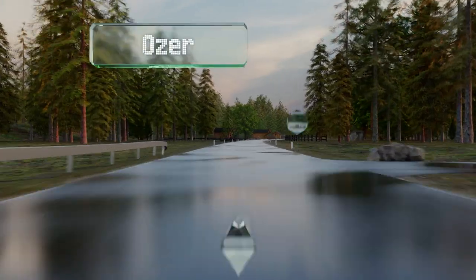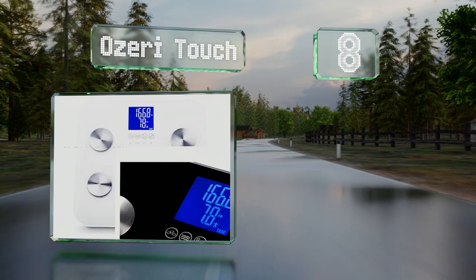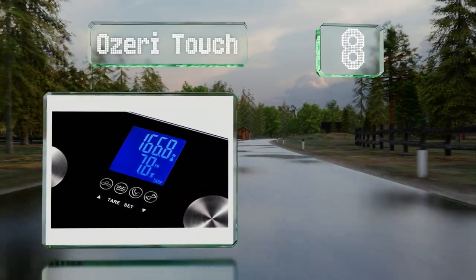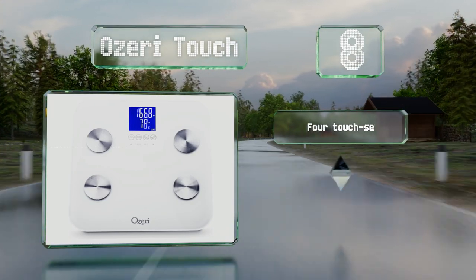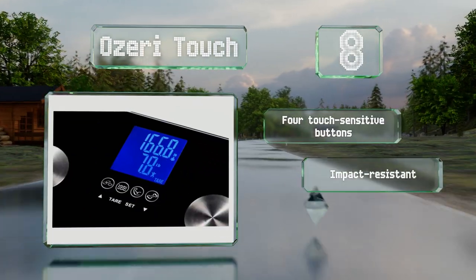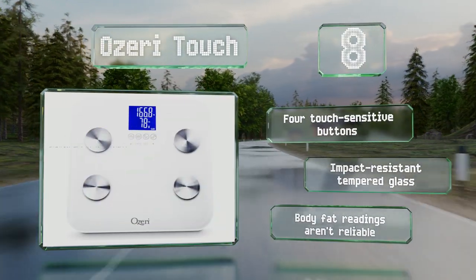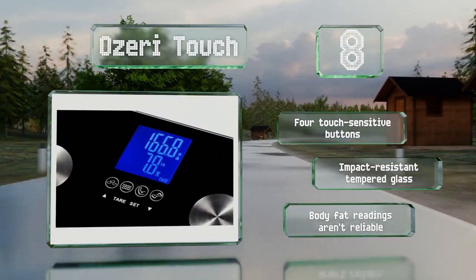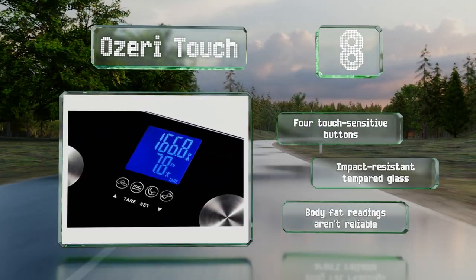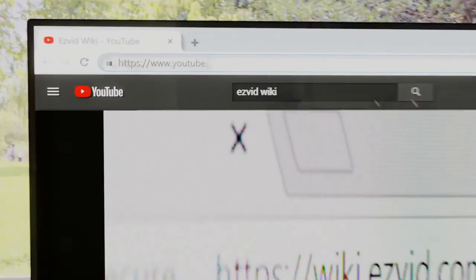Coming in at number eight on our list, the Ozeri Touch boasts an impressive 440-pound capacity plus a tare feature that's helpful for weighing other items. If you have an overweight pet that's on a diet, this is a great tool for tracking its progress, or it can save you from paying excess baggage fees. It comes with four touch-sensitive buttons and impact-resistant tempered glass, however its body fat readings aren't reliable.